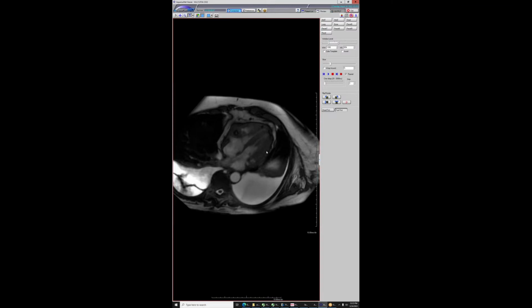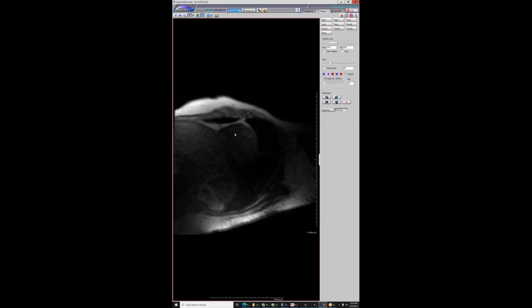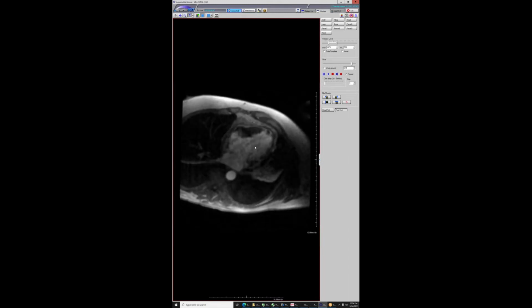So this guy has a squame of the head and neck, and I've seen now a couple times metastatic squames go exactly to this area. You know, lymphoma is not going to be necrotic like this. The thing didn't perfuse at all. I mean, it perfused a little bit on the perfusion images, but it was so necrotic that most of it didn't perfuse. You see all these areas of necrosis. Angiosarcomas are not going to do this. They don't really necrose like this too much. Lymphoma doesn't do this either.